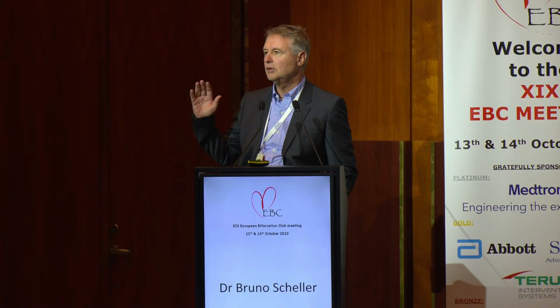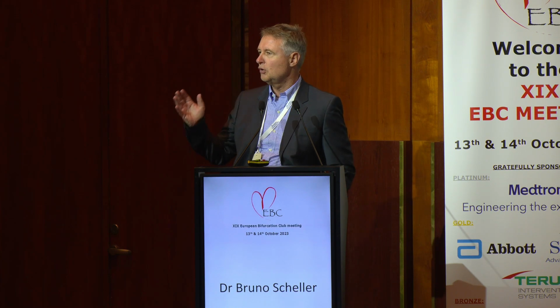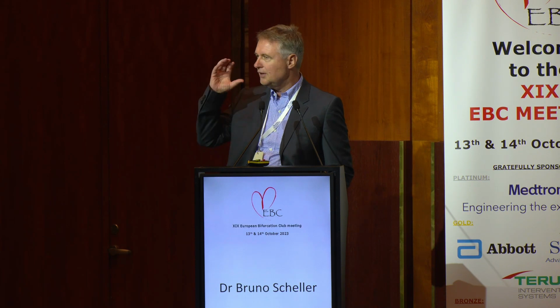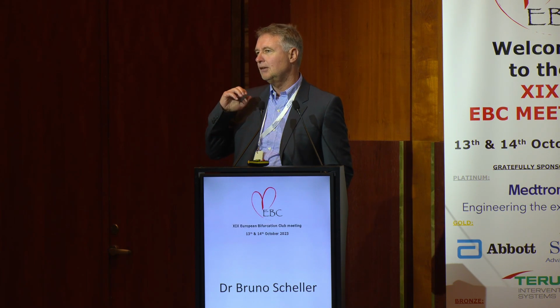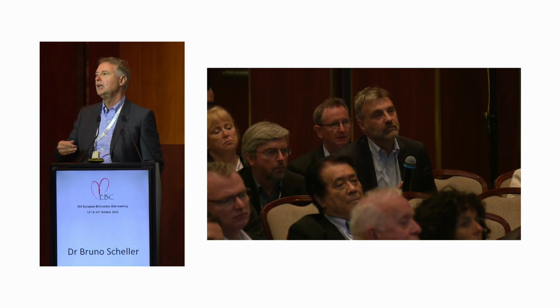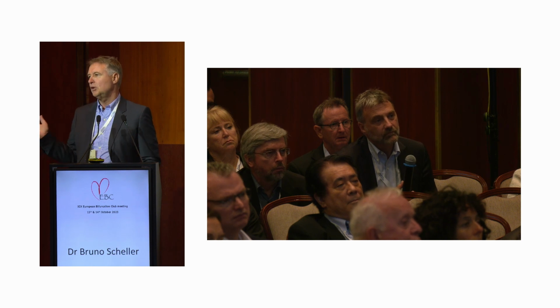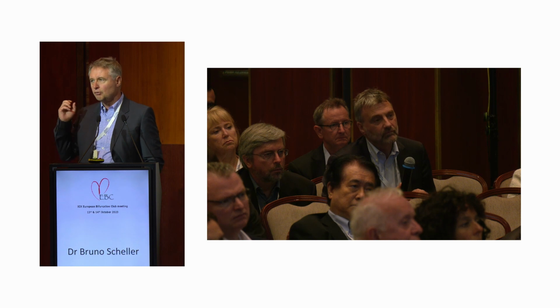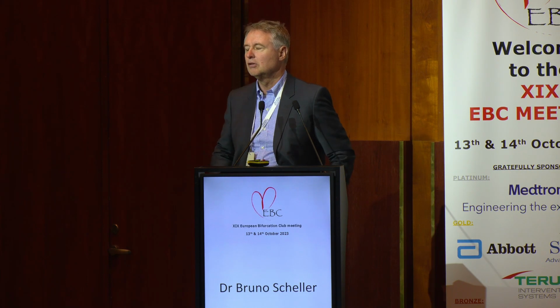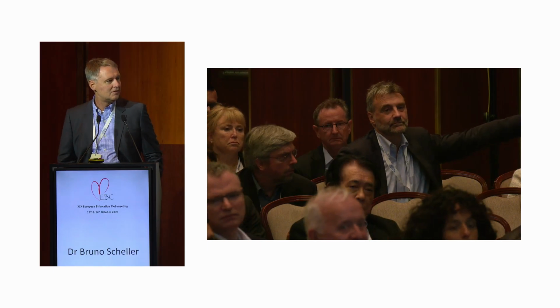Very important point. In cardiogenic shock, you have excessive catecholamines in your body. Everything is narrowed. If you implant a stent, you frequently induce additional spasm, and that's of course a situation where I only try to do balloon angioplasty, and only if I have good flow, then I use DCB in this situation. But it's a rare event.